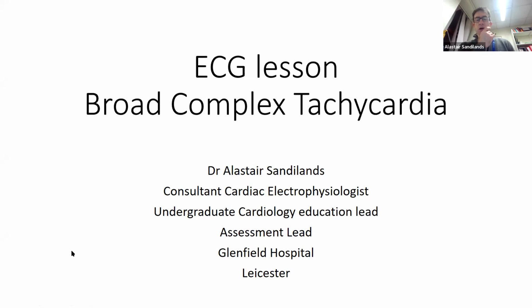Okay, welcome to, I think it's now the 5th lecture. Today we're going to do broad complex tachycardias, moving on from narrow complex tachycardias last week. I'm Dr. Sandilands, you all know me.